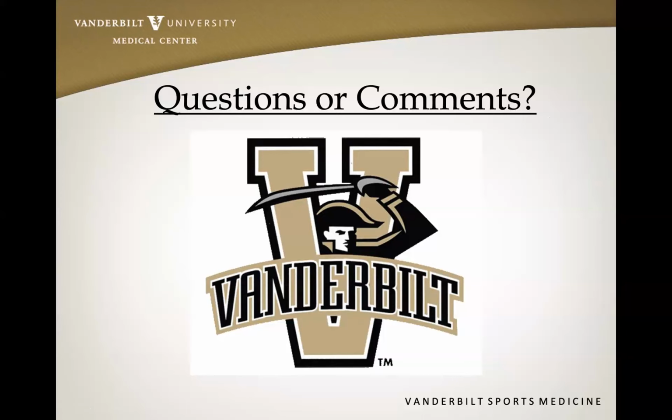With the ulnar and radial deviation, my experience has been that the patients can usually reproduce it best when they actively do it, compared to when I passively do it. But I have a harder time staying on the correct location when they're actively doing it. And so I've struggled a little bit with that, and gripping is primarily what I've done in the past. But once again, it's certainly an area that we need better data on.